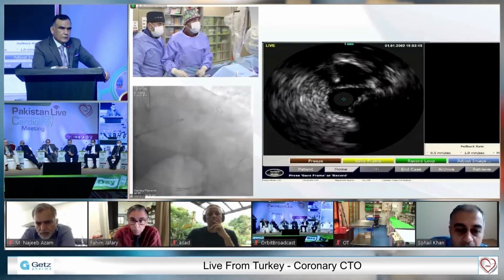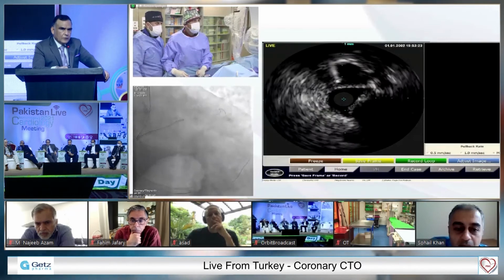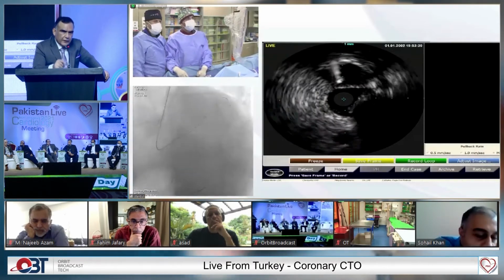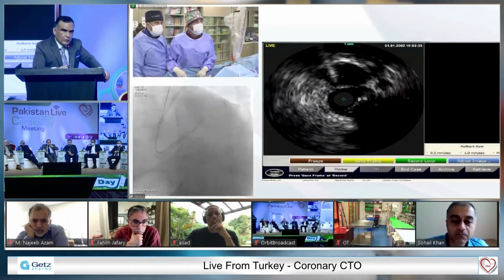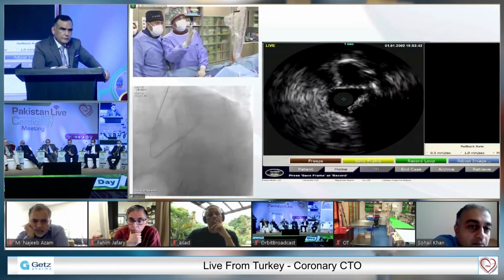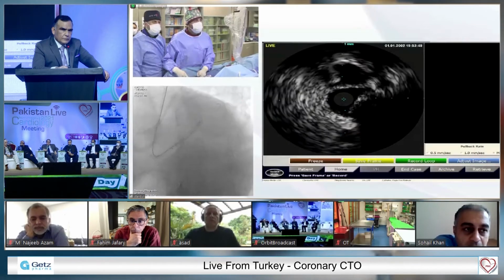Yeah. No, I think I'm engaging the, but I slip, I believe, no? I think I slip there. Let's go to Spider, maybe. For the fellows, you can see the wire shadow at the place where Dr. Kotkin wants it on the IVUS. My wire direction is on the left side, rather than to the diagonal.